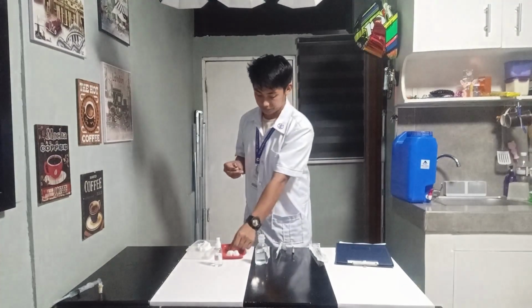Then we have to hold the ampule slightly towards the inside in order to obtain more than the amount of the medication prescribed. Now carefully withdraw the medication prescribed.